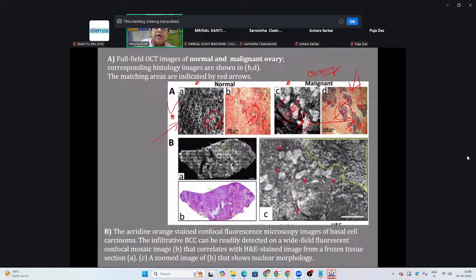And in this optical image, where I have put the round circle, this is less dark. It's more whitish. So one more time, take a look. This is more whitish, and what they're saying is it is in this location that it is slightly darker. So this is the histology image.